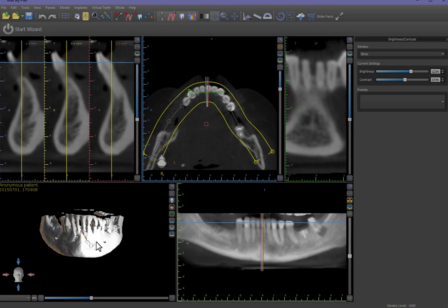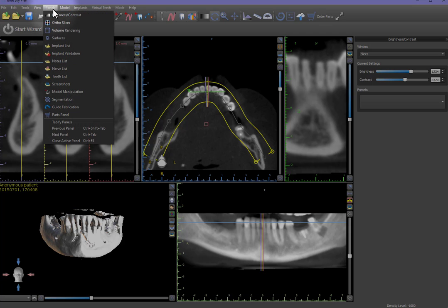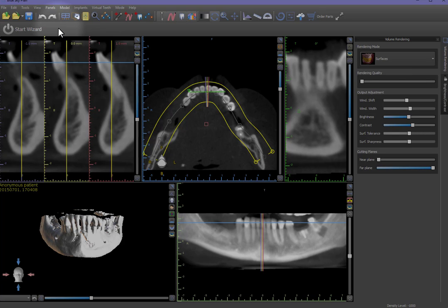For further tweaking, open the Volume Rendering panel from the Panels menu. Left-click on the Panels menu, then left-click on Volume Rendering. The Volume Rendering panel will open. Left-drag on the relevant slide bar handles to obtain the most favorable 3D image.